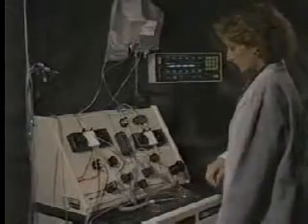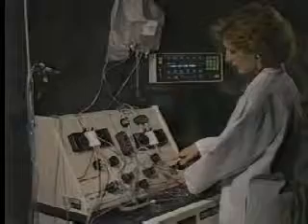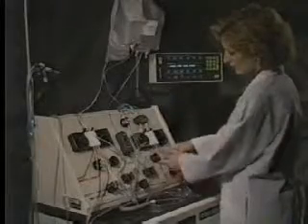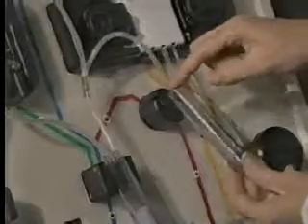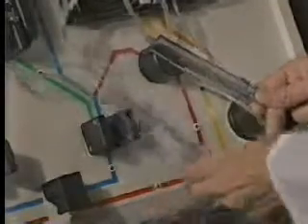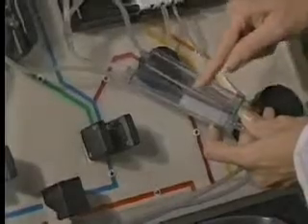Next, we need to load the RBC valve and detector. The RBC line attaches to the Y going to the return air chamber. This line includes the RBC reservoir, which is unique to the AUPBSC disposable set. The RBC reservoir can be distinguished from the air chambers by the absence of the filters.